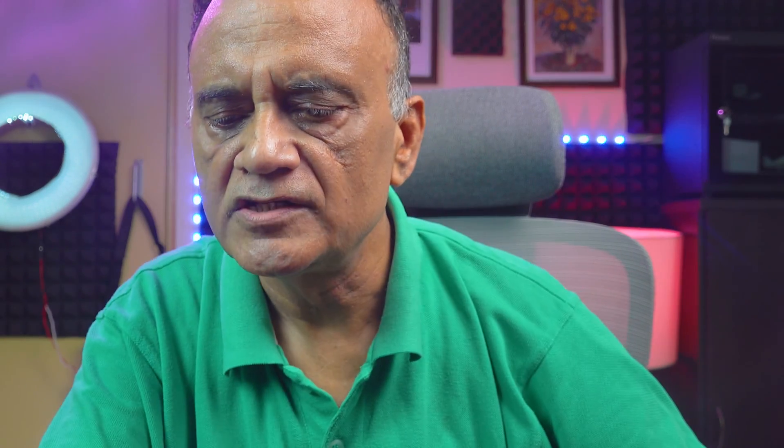I now open the Libre Pro Reader and peel off the plastic. I set the date — 2nd February 2023. The time is also showing the exact time, 8:25 a.m. I then set the target glucose range: the lower limit is set to 70 and the upper limit is set to 140. So my target interval is between 70 and 140.